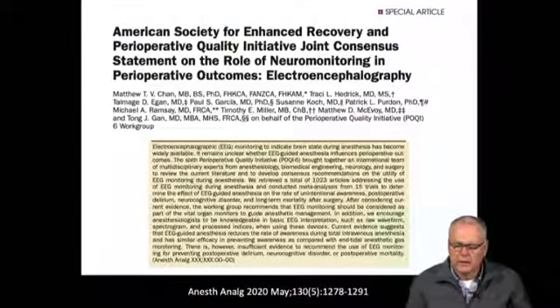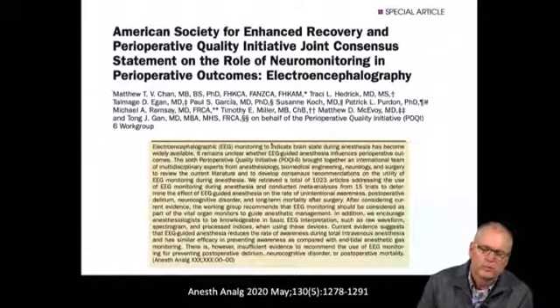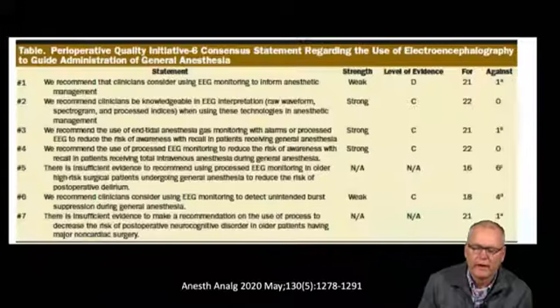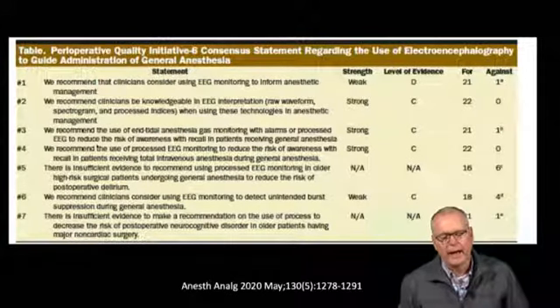I'd just like to end this by pointing out that a group of experts in processed EEG monitoring recently got together and prepared a consensus statement. A summary of that consensus statement is probably worth taking a look at.